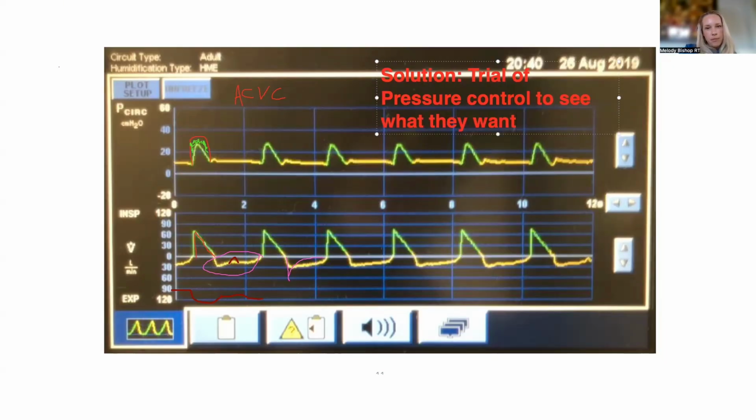I agree. I would probably switch them to pressure control or pressure support for that matter. Now the issue becomes that this most likely isn't a switch it and then we're heading back to the call room situation, right? Because as much as this patient's working, they can certainly pull a big volume, which depending on the lung mechanics could be good or bad. Meaning, if they have normal mechanics and they pull a big volume, you might be worried about volume trauma.